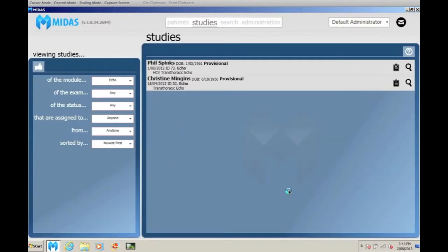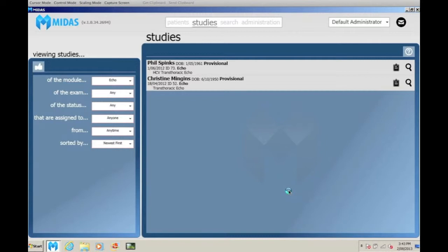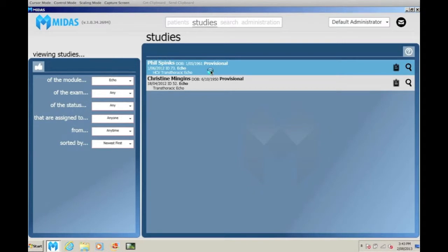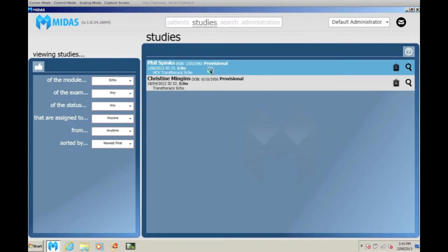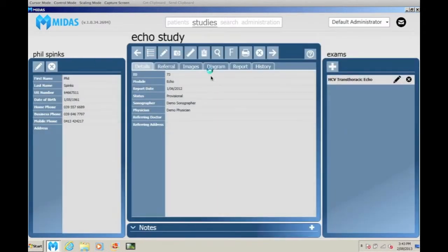Individual user logins allow MIDAS to be customized to the user's common tasks. A cardiac sonographer logging in will see a list of studies that require input of observations and measurements.